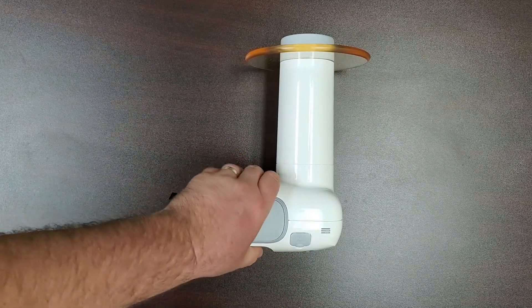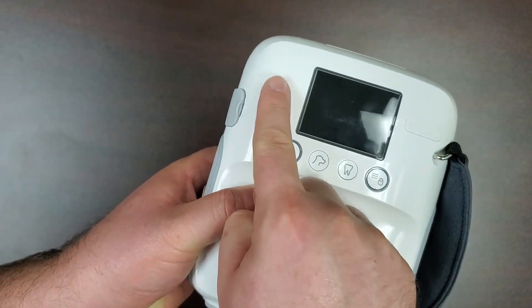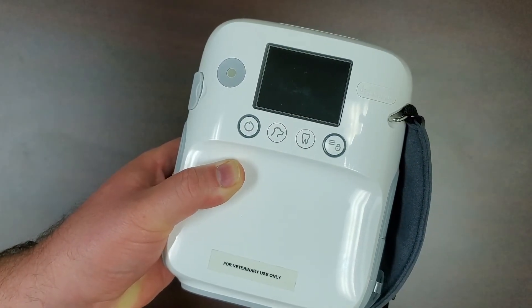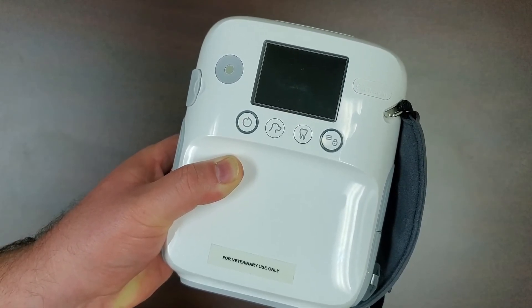On the back of the unit, you will find the display screen. You will also find the trackball, power, size, position, and menu buttons. Please note that many of these buttons can be context sensitive and control different functions within the menus.